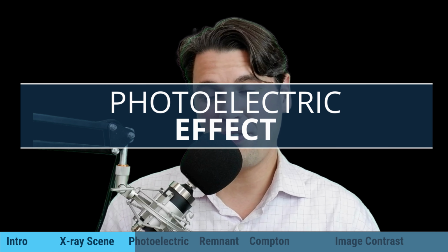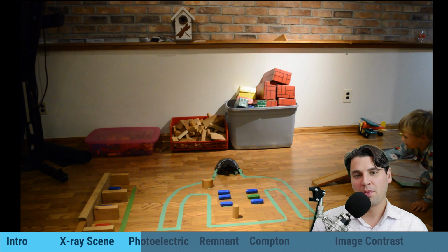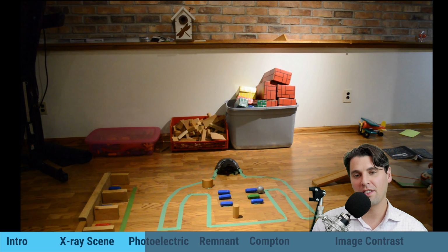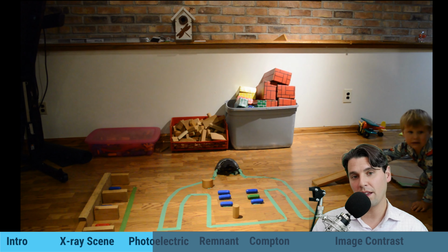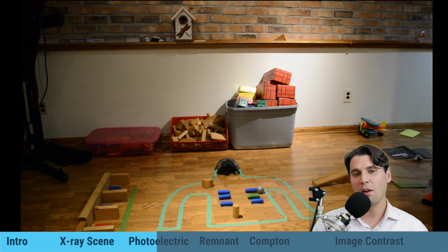The photoelectric effect is the first demonstration we're going to show. As my son rolls the ball through, if the X-ray stops locally, for instance in a bone, X-rays would be more likely to stop locally in the bone due to the photoelectric effect. So they will deposit their energy locally in the bone if they interact via the photoelectric effect, and they will not pass through onto the detector.